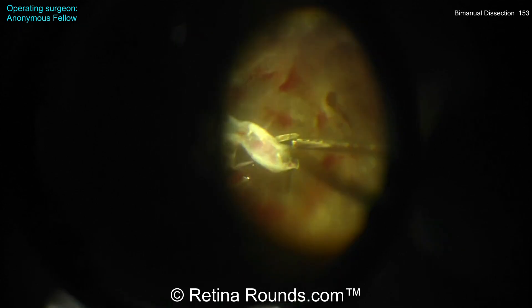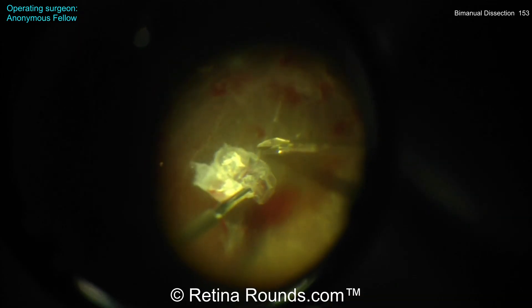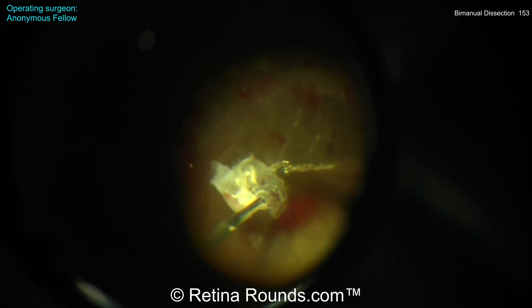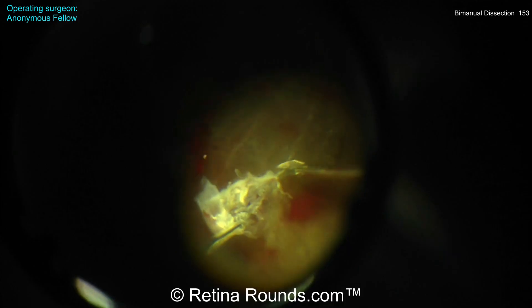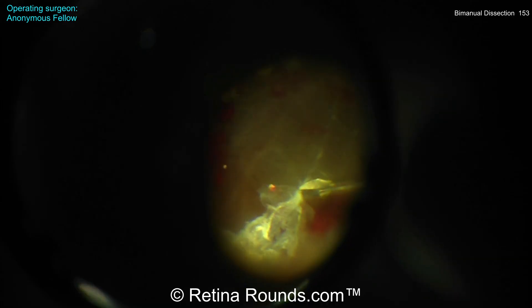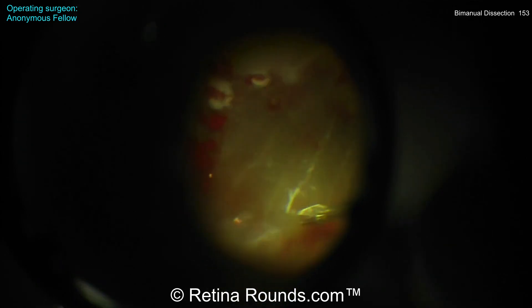Going nasal-to-temporal, using the forceps to reveal that plane, and then the scissors are being used to very carefully cut these fibrovascular stalks from the retinal surface. You can see how efficient this is at removing these membranes without creating undue traction on the retina and without creating any iatrogenic retinal breaks in this case.